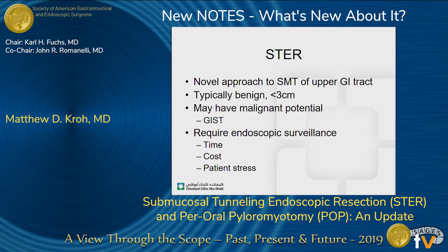So STER is a novel approach really to submucosal tumors, SMTs of the upper GI tract, esophagus, and stomach for the most part. It's applied to lesions that are often less than 3 centimeters in size. It seems to be a reasonable and optimal size for resection. Some of these lesions may have malignant potential. Most commonly, these are gastrointestinal stromal tumors that could progress to malignancy. And for these small lesions that sometimes may be considered insignificant, there is a requirement for endoscopic surveillance, and this involves time, cost, and patient stress for continued evaluation.